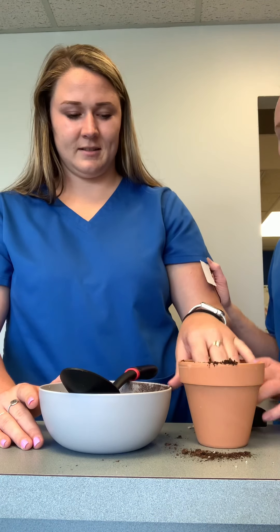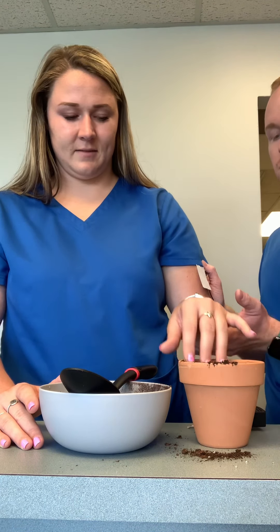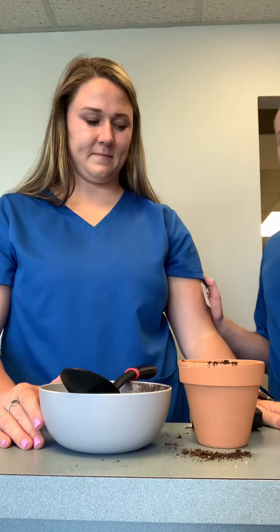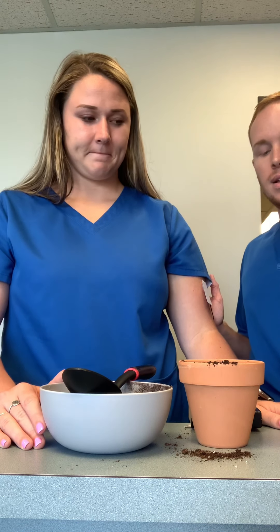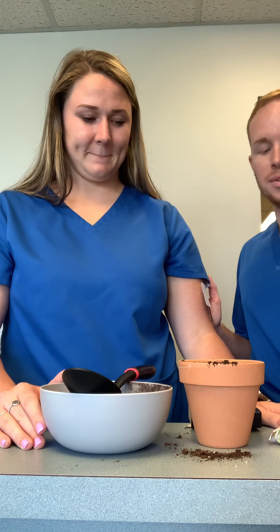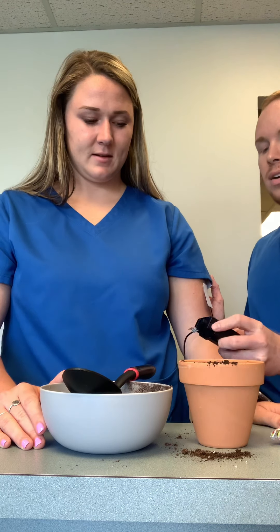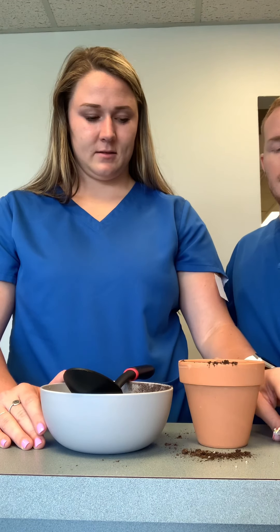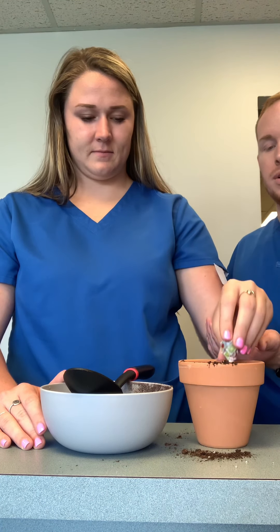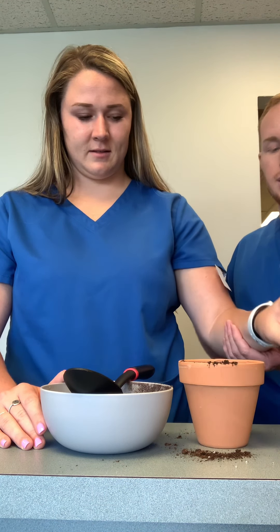So let's take a break — I'm going to cut this off for a second. Let's relax for a minute and then we'll go into the next step. A couple minutes have passed. We are going to then plant the suckers. So let's turn it back on, get it to where it's supposed to be. And when it's on and activating, I'm going to have you grab and we're going to plant that in there just like that.